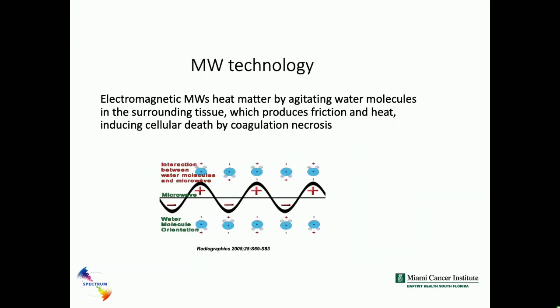Next slide, please. So very quickly, I'm just going to run through microwave because some patients have been interested in this technology and have been recommended to go through with this technology. We use a lot of microwave, cryo, and IRE in our practice, but I feel that, again, we've not done a huge number, but for the EHE world, I think that's about 20 patients with significantly more number of lesions. If the tumor is away from a critical structure, not near a major vessel, I think microwave might be able to overpower the effect of the growth along the venules and give you an ablation zone, because here you're using electromagnetic waves and you're creating frictional heat and cell death happens by coagulation necrosis.